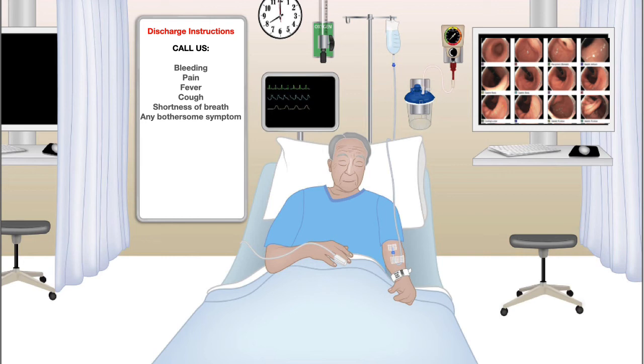By being proactive, we could avoid or minimize these adverse events: GI bleeding, perforation, aspiration pneumonia, and injury to adjacent organs. So let us briefly review some of the adverse events. How do we recognize them and how do we manage them?